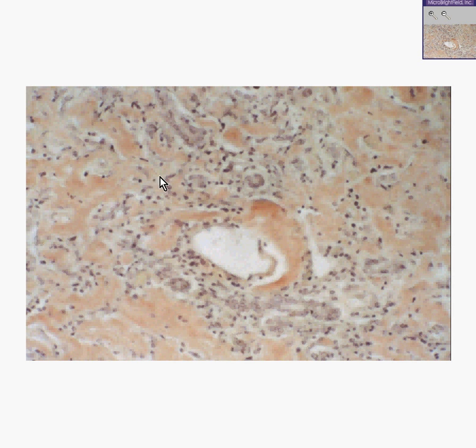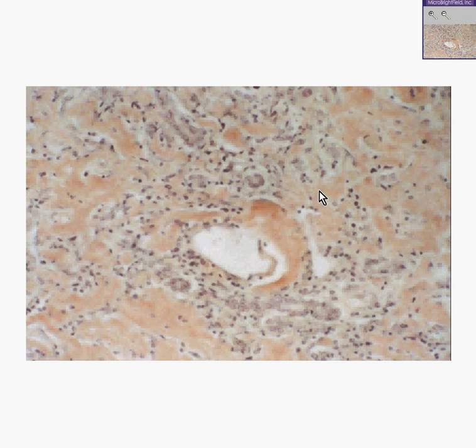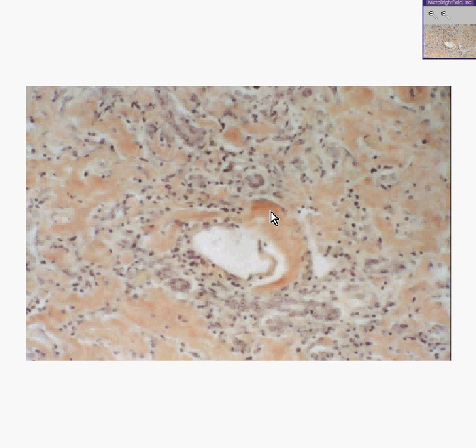Sure enough, the amorphous areas stain a little pinkish red. That's why it's called Congo red. Here it is redder than here. Here it is mildly pink. Here it is a little bit redder. But let's say we took this Congo red stain now, which is staining this red material between the hepatocytes, and we decided to put it under polarized light.